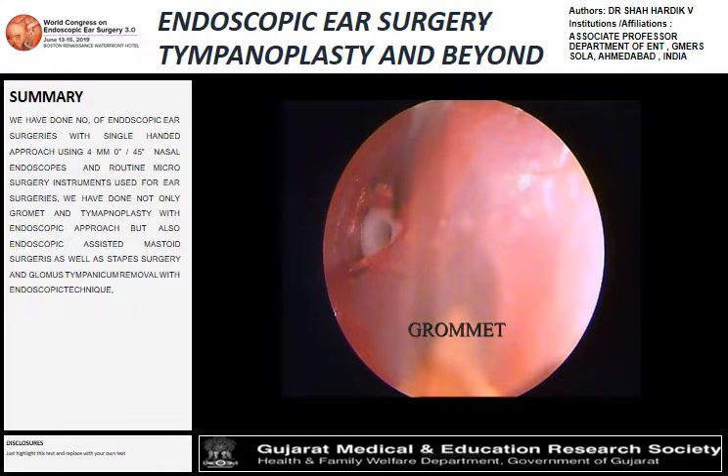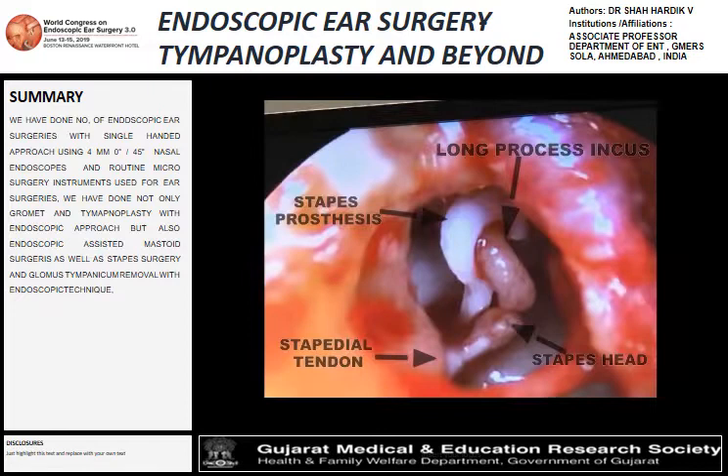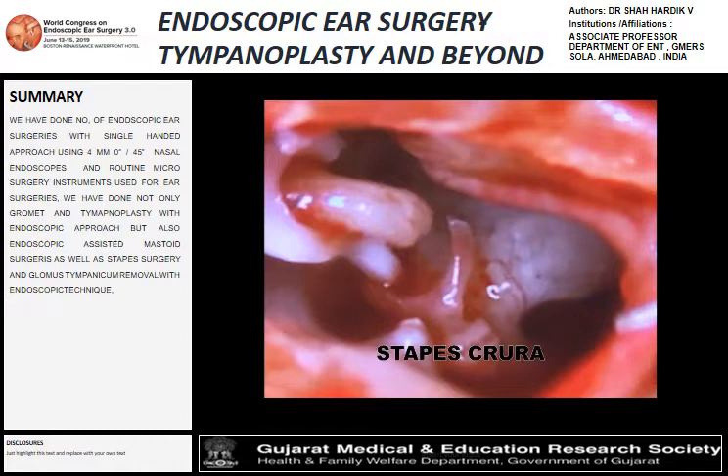We don't need any extra instruments for performing an endoscopic ear procedure. For the stapes surgery, we don't have the full video, but pictures show the crura cutting and stapedial tendon with the piston, and the whole assembly along with the repositioning of the tympanomeatal flap.